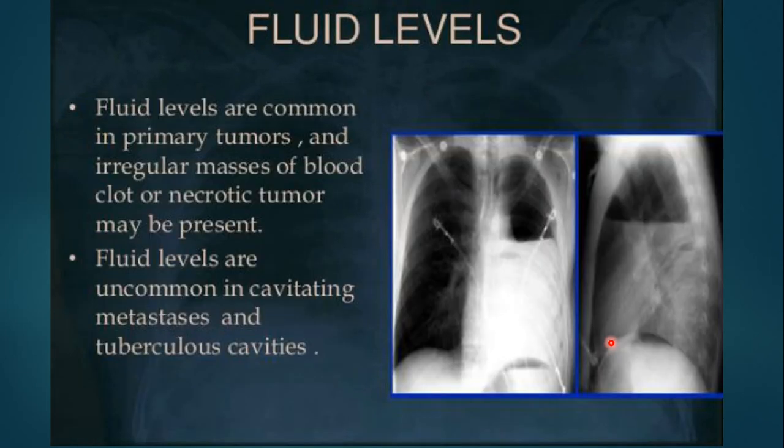Now, let's talk a little bit about fluid levels. If we see a fluid level in the lung, first of all, you can't have a fluid level if you don't have air, it's always, always air fluid level. If there is no air here, there will be no fluid level here. Okay? Must have an air filled cavity to have a fluid level.